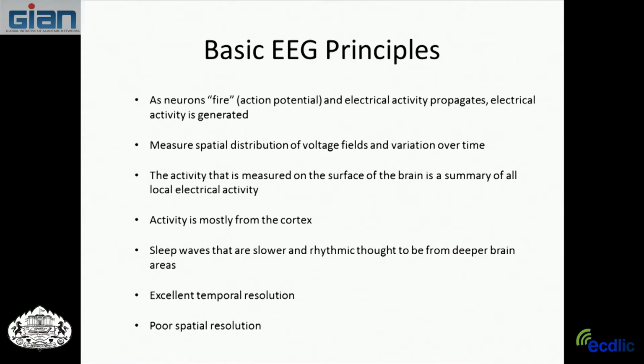So we went a great deal over EEG and the principles of EEG, how these are, again, thought to be direct measures of neuron firing, and these are actually summations of the processes going on underneath the scalp. So we are not making assumptions that we're looking at single neurons or groups of neurons.